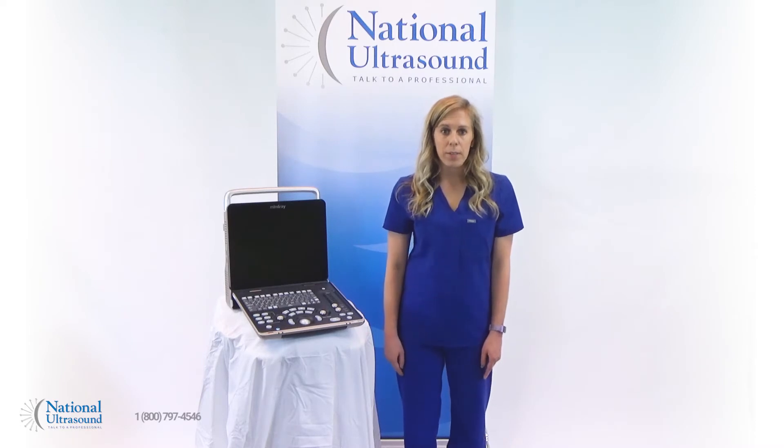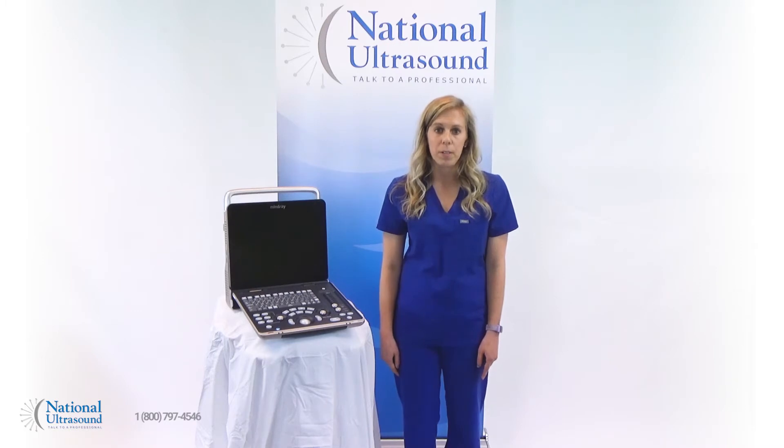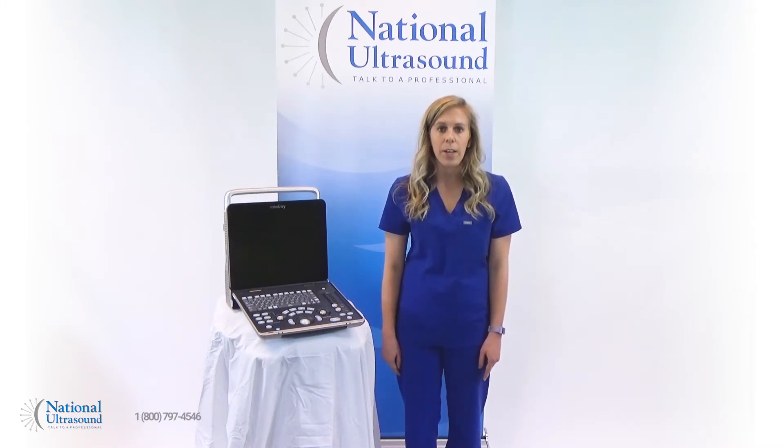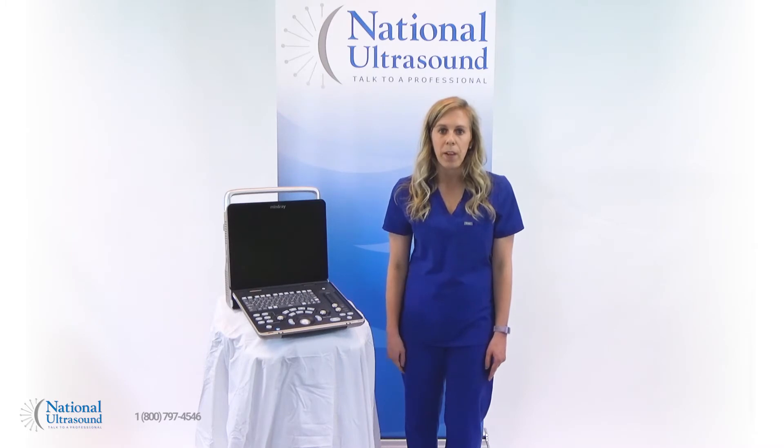The Mindray Z60 ultrasound is a perfect solution for the practice looking to perform consistent OBGYN, basic cardiac, vascular, and general imaging exams. The Z60 harnesses high-end technologies like pulse wave Doppler with high pulse repetition frequency in order to deliver outstanding image quality from a mid-level machine.